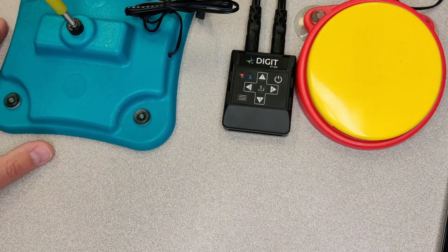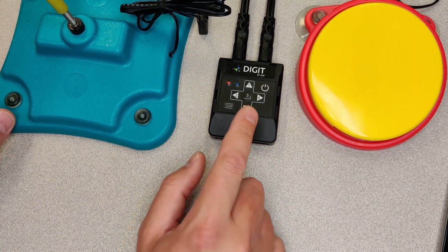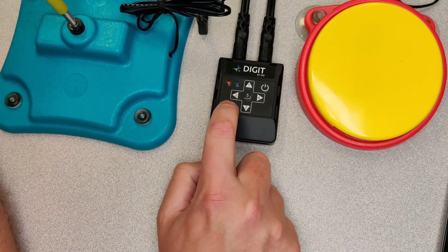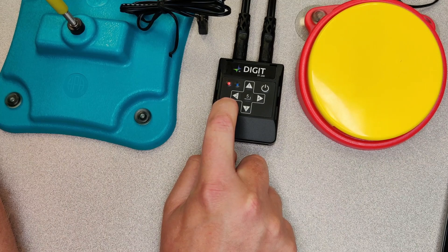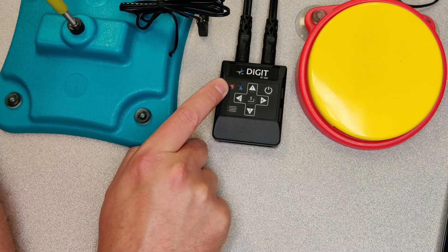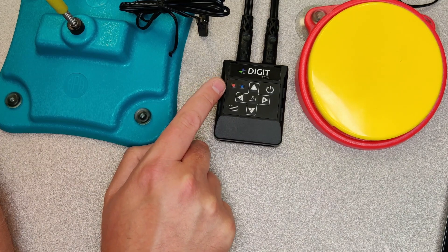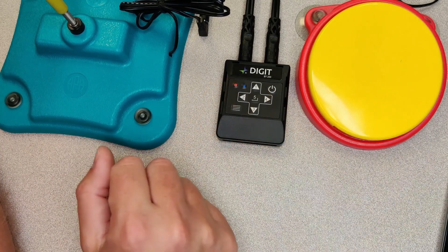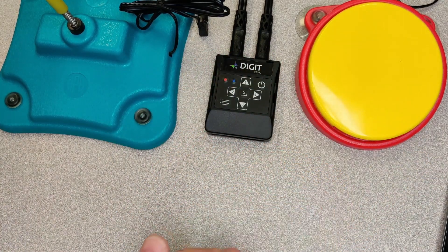To start things off, we have our Digit. What I found is that we need to be on mode five for this to work well with the iPad. To do that, we click the mode button and have it blink five times. I'm going to press it down — one, two, three, four, five. It blinked five times back, but the power button was blinking red showing what step it was on, so it stepped through five times. Then the blue will blink because it's connected to the iPad, putting it in a mode where the iPad and software work together.